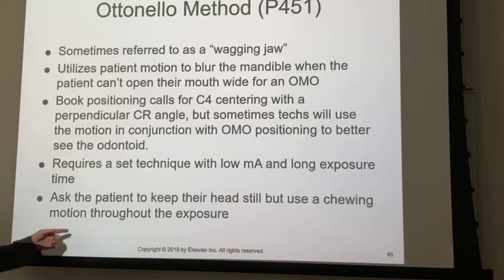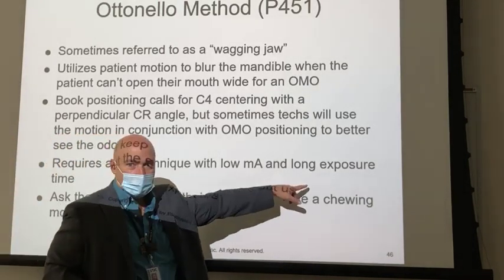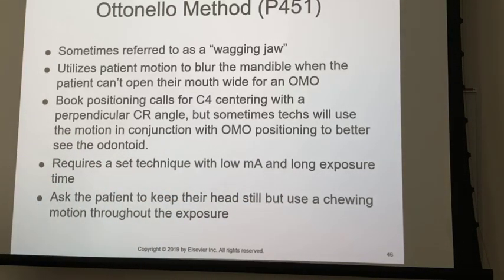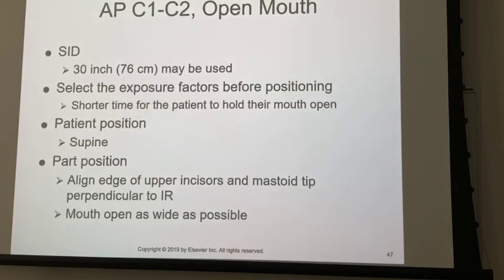In order to accomplish that, though, what you're going to have is a low mA setting with a long exposure time. If you use a fast exposure time, you're just not going to see it. So you're going to need 1, 2, 3 seconds to take advantage of that.